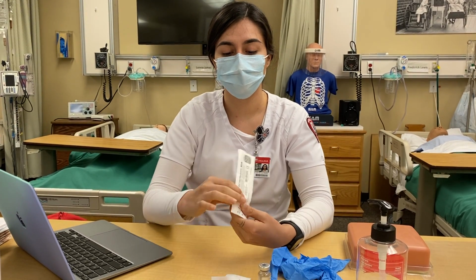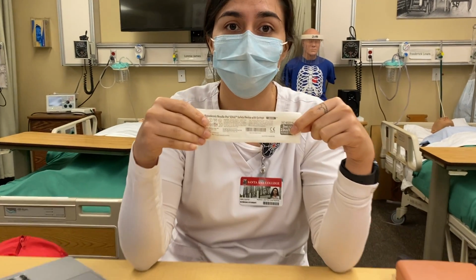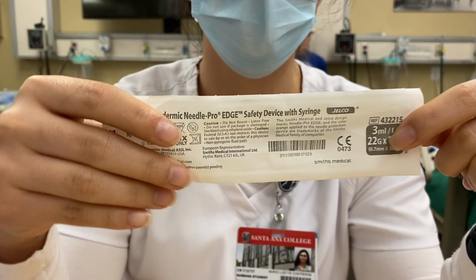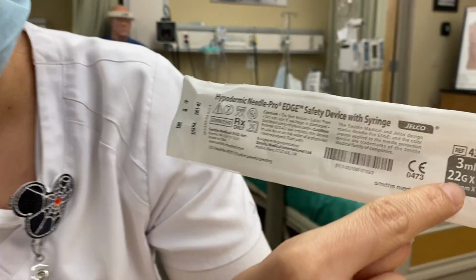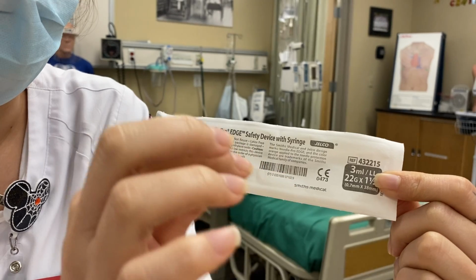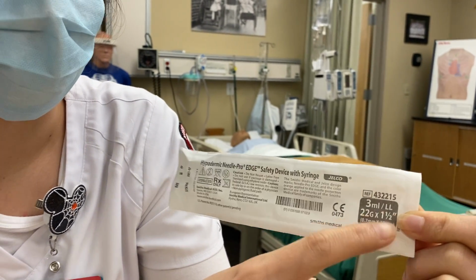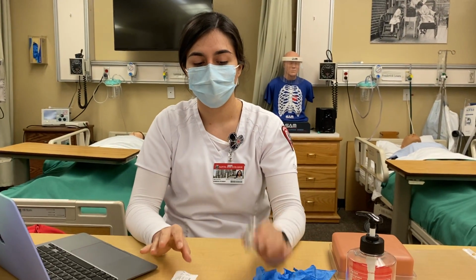So I'm going to get a needle. For IM injections, the gauge is typically bigger compared to a sub-Q. This is a 22 gauge right here. Typically for IM injections, it's 20 to 25 gauge, and the needle size is also larger, so it's going to be a 1 to 1.5 inch needle size. Okay. So I'm going to get my needle and then I'm going to get my medication.